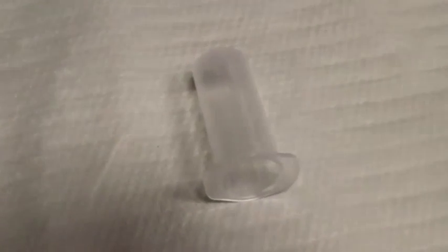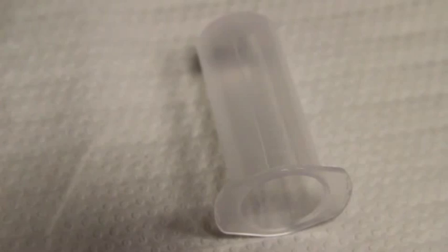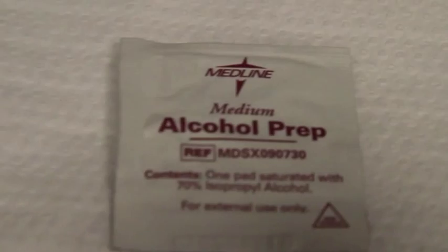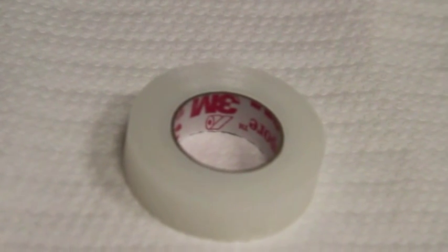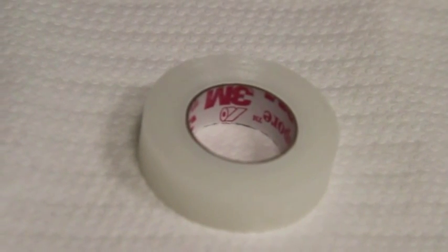The disposable plastic tube holder is to hold the vacutainer tube in place. It is very important to use the correct disinfectant on the phlebotomy site. Presently, use is made of a 70% alcohol swab. The clean gauze pad is used for covering the puncture site post-procedure. The tape is used to secure the gauze pad after the procedure is totally completed.